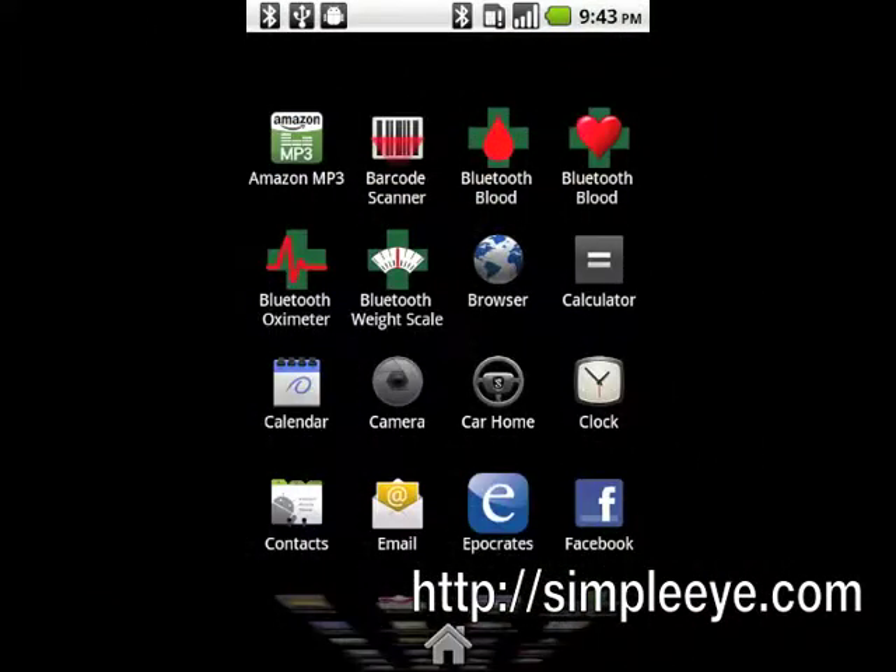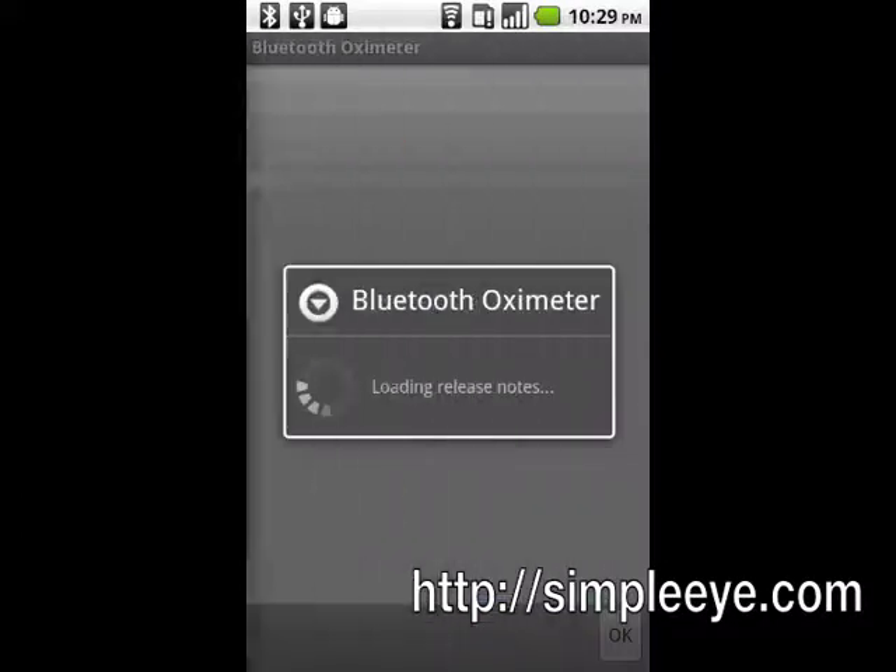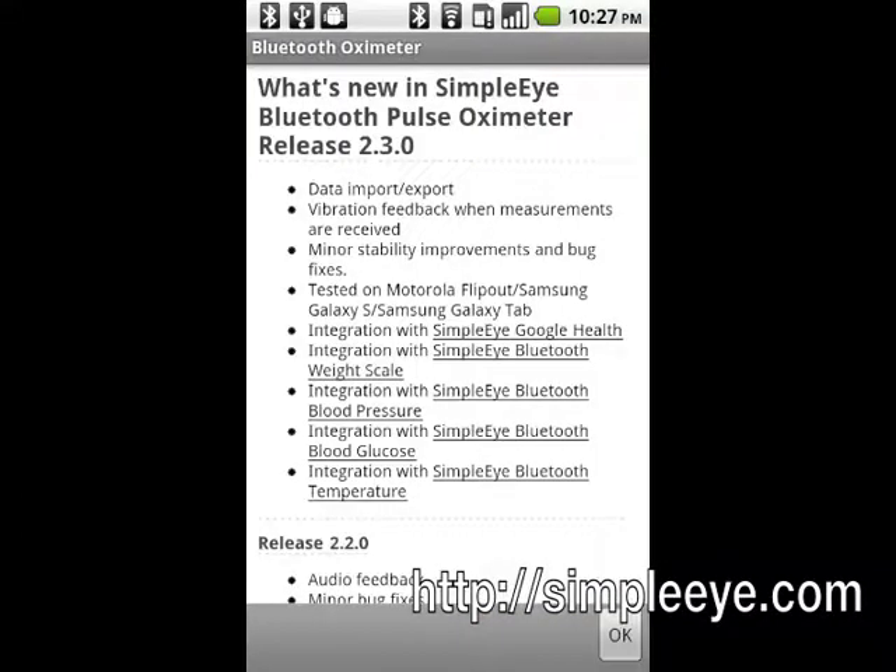Start the Simple Eye Bluetooth Pulse Oximeter app. The first time it is started, it will display a list of changes. Tap OK to continue.